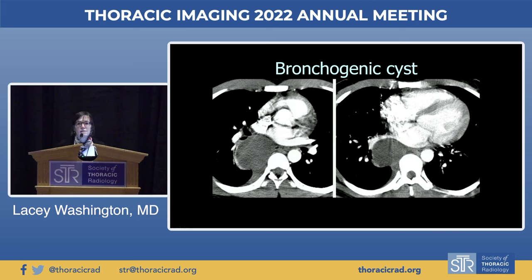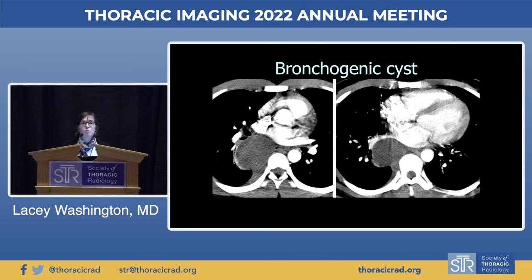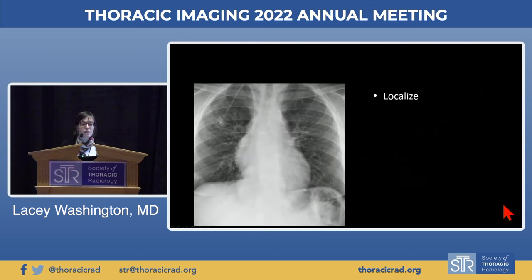On the lateral, this is a more middle mediastinal lesion — a pretty classic location and appearance for a large bronchogenic cyst. Unlike pericardial cysts, these don't have to be of pure water attenuation; they can be proteinaceous, but they should not enhance with contrast.